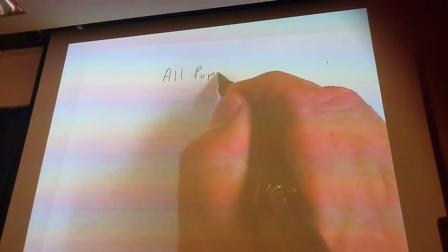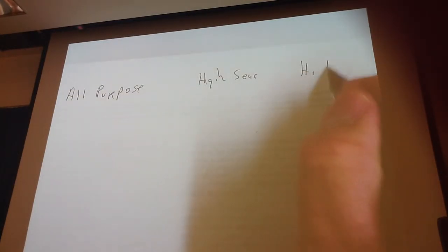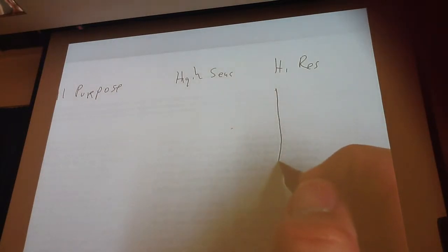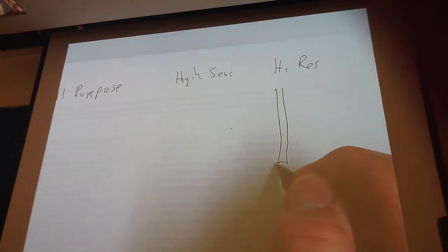The other thing that I talk about, low energy all-purpose. Basically, to understand what we mean by all-purpose, versus high sensitivity versus high resolution. Okay, if we wanted something to have high resolution, typically we make it a very long tube with a very narrow opening in it. Okay, so this would be the opening here.